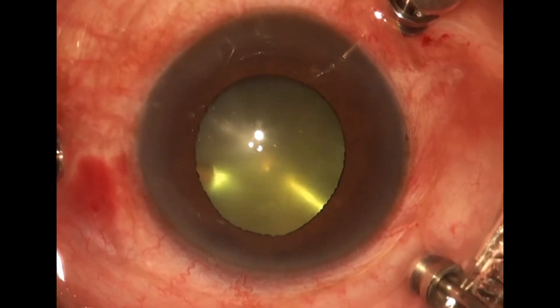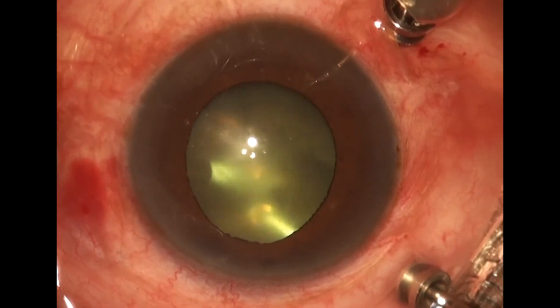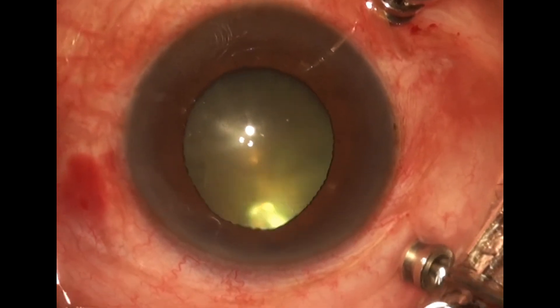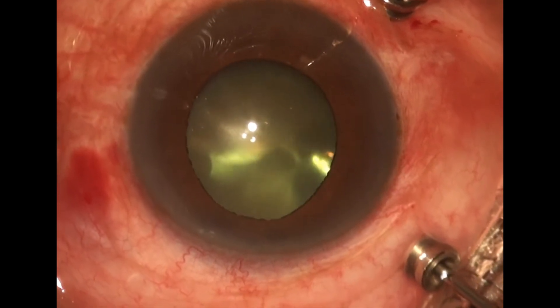Hi guys, welcome back. Today we deal with a case of retinal vasculitis. We have started using a 23 gauge MIVS system. We are clearing the blood in the anterior vitreous and then we proceed to clear the vitreous haemorrhage.